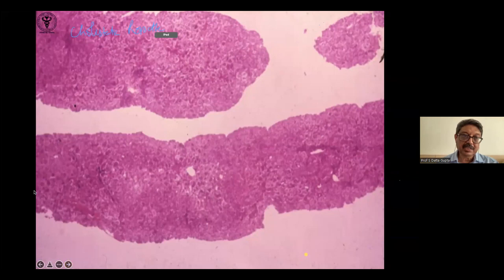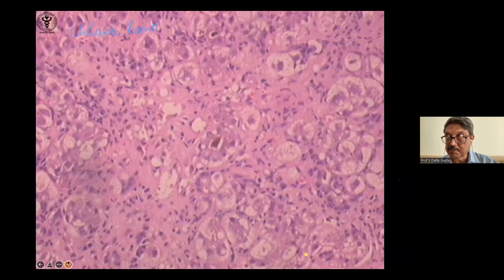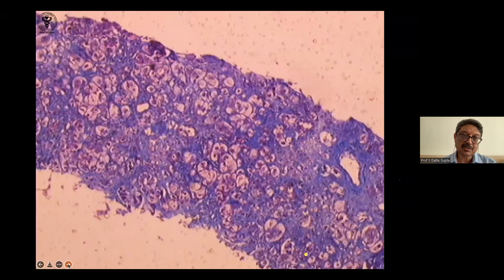Remember, in acute hepatitis, the changes are diffuse. It affects all the lobules almost equally, centrizonal more than periportal, zone 3 more than zone 1. But in chronic hepatitis, it is always patchy, and the portal areas are affected more than the centrizonal areas. Do you get fibrosis in acute hepatitis? No. The exception is fibrosing cholestatic hepatitis, which is seen in immunocompromised individuals, post-transplant, HIV, and so on. This is acute hepatitis with a lot of fibrosis.